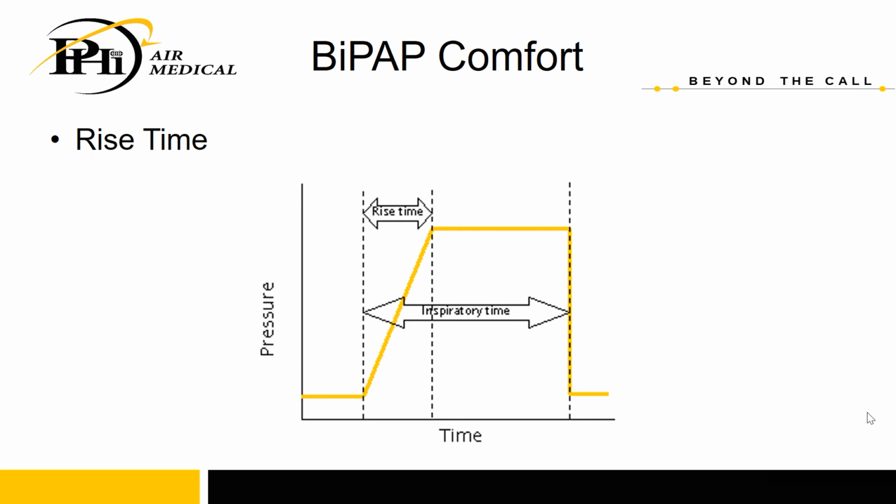And I know that just anecdotally from when I put myself on BiPAP, when I just practice doing BiPAP and making myself comfortable, I need a rise time of about 5 in order to make myself comfortable. If I reduce it down to 2, then it is very uncomfortable for me, and I feel like I'm getting blasted in the face with this pressure. If somebody's pretty short of breath, though, they may want exactly that. They may want that rise time of 2.